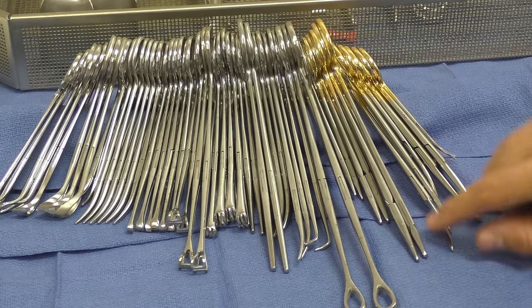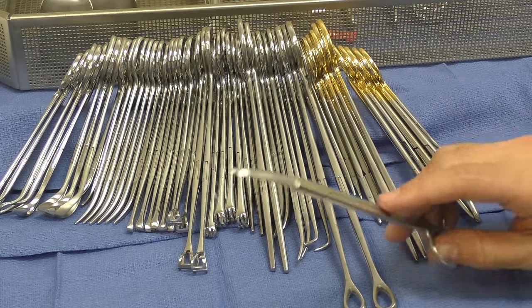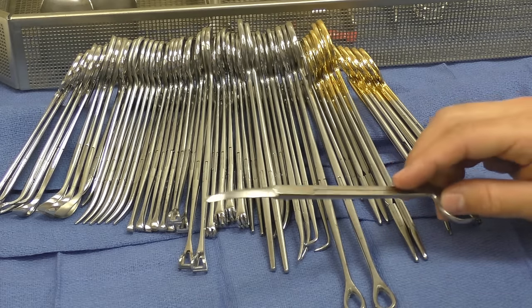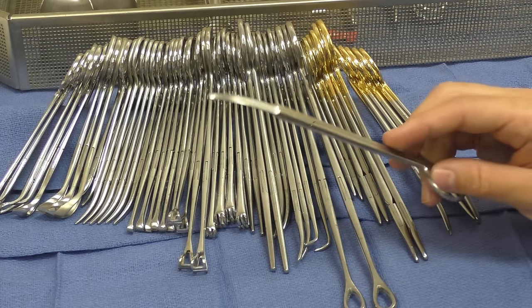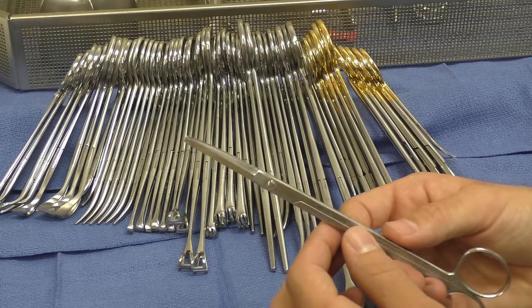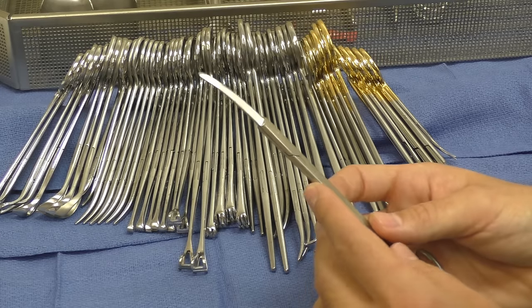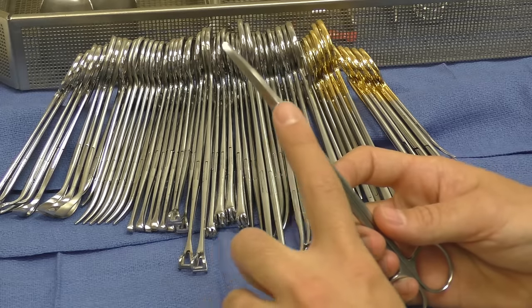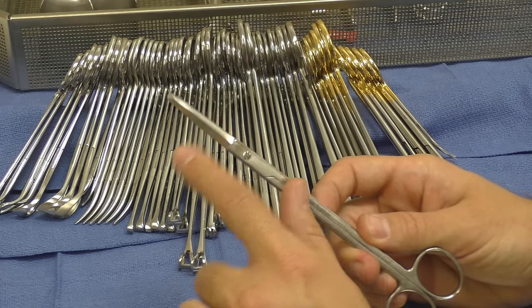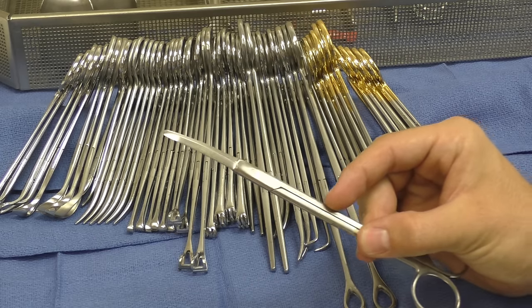Now that we're at the end of the stringer here, we have 2, 4, 6 scissors that we have to go through. This is the Potts Smith scissor. This scissor obviously is used for dissection and all that stuff. All these scissors are used for dissection. And this is used in vascular a lot. I don't see it used in general surgery a lot. There may be some general surgeons that like to use it, but you will know it's a Potts Smith because it has these bevels on either side of each side of the scissor itself. And it'll have this nice little line going to the tip of the scissor.